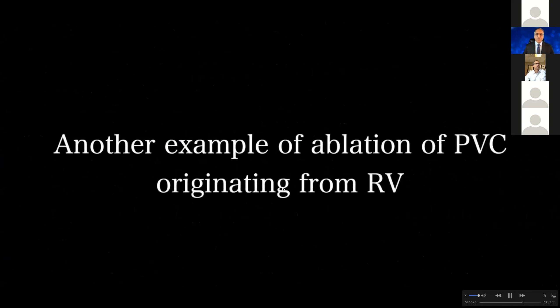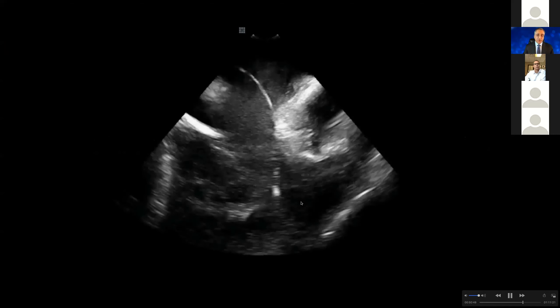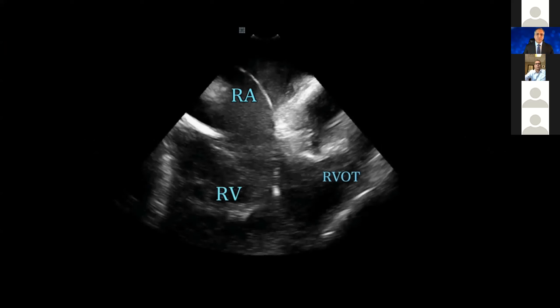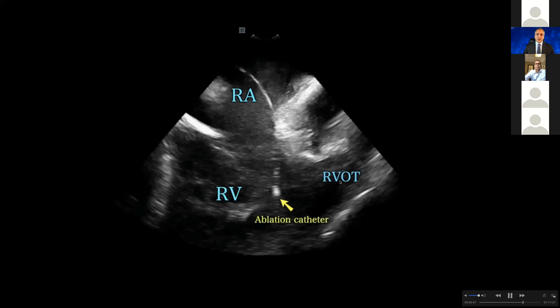So another example of ablation of PVC, this time originating again from the right ventricle. But I want to show you how ICE is so crucial to see this stuff. You can see RA, RV, and RVOT, and this is my ablation catheter. You shouldn't be satisfied with this view — you see the ablation catheter but have no idea where it is touching. You just know it is at the base of the RVOT, but you don't exactly know what it is.